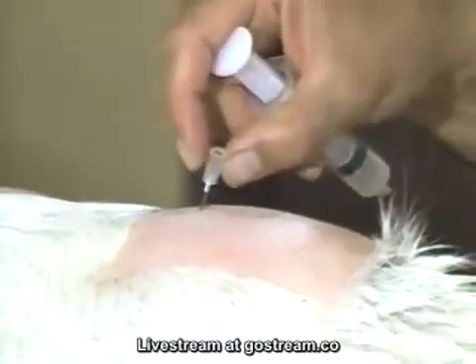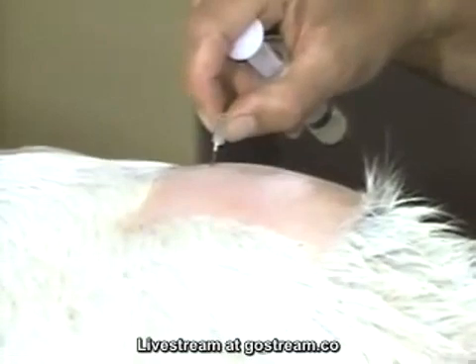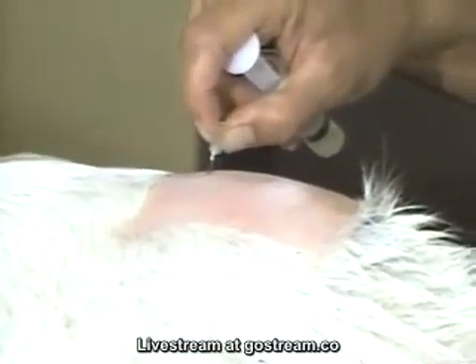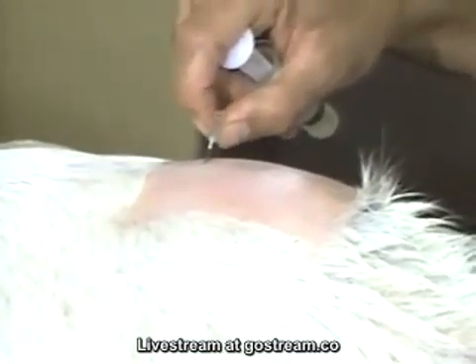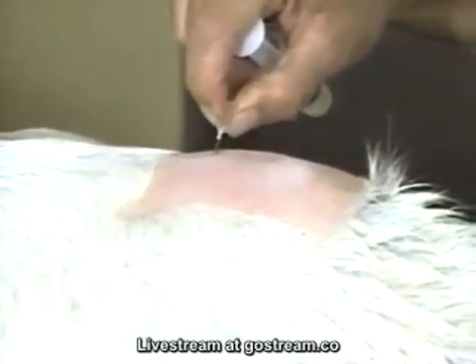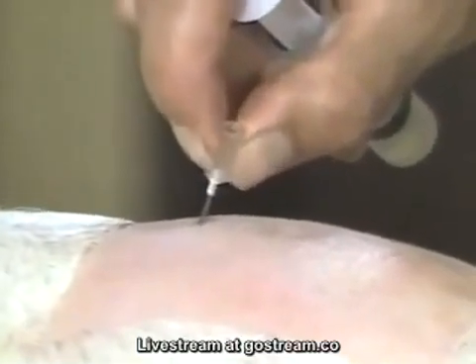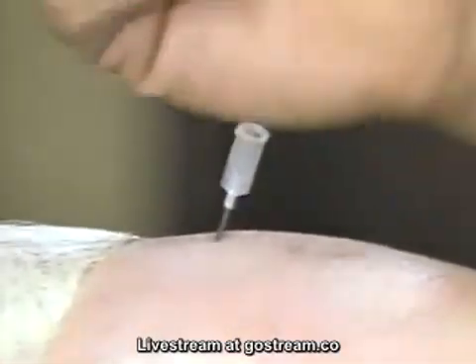There are some tests to determine when this needle is in the right spot. You can see that approximately one inch of that needle is buried. I felt that it went through some ligamentous tissue, and now it's resting just onto bony tissue. I've withdrawn it just a very small amount.